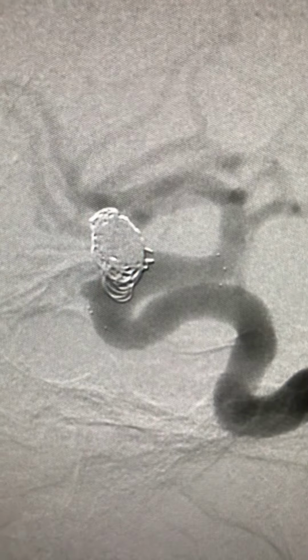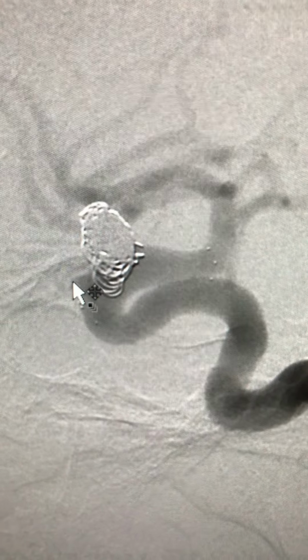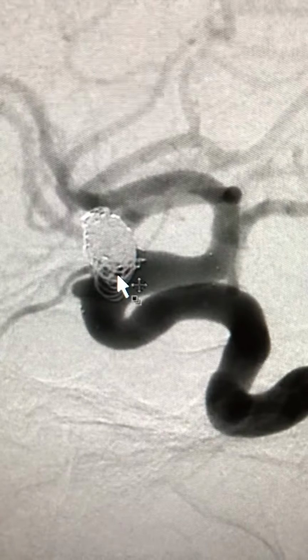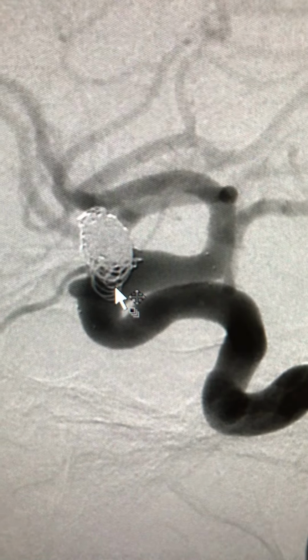So this is the final picture. This is a stent. You can see it here, proximal and distal. This is a tiny aneurysm that I did not do anything about for the time being. This is the sac which is occluded. This is part of the sac as well. It's not in the parent artery.